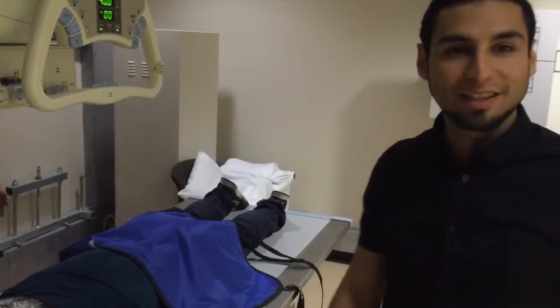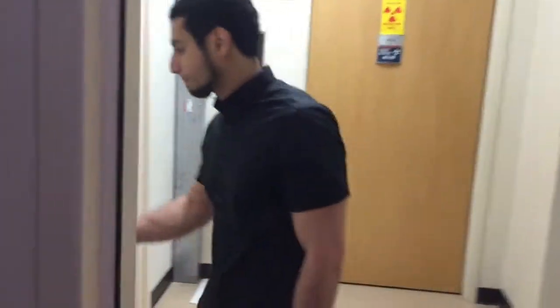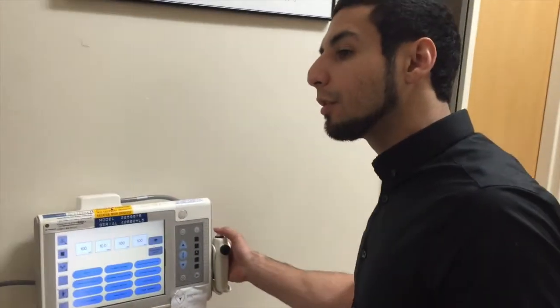And then we will move on to exposing our patient. Hold your breath.